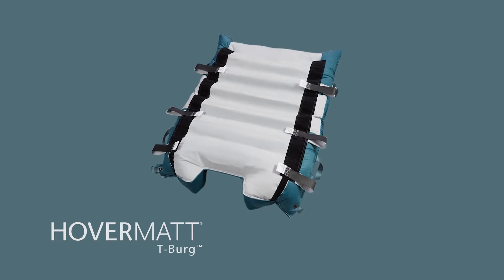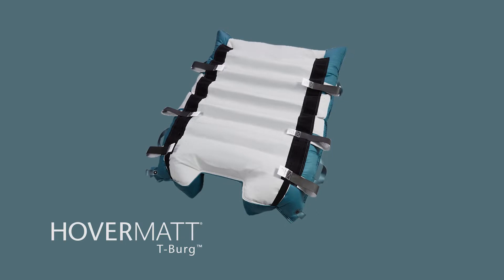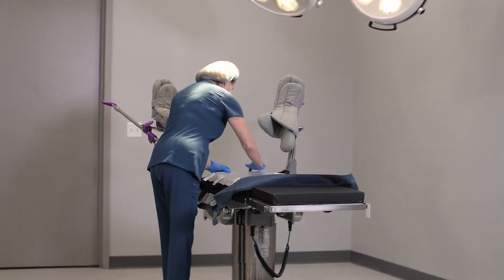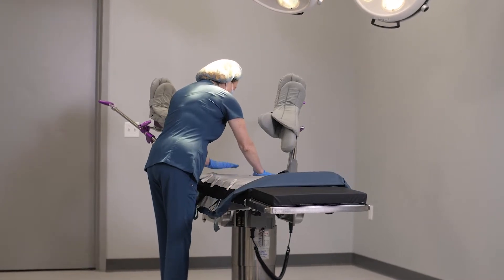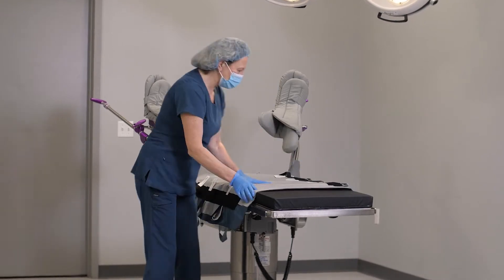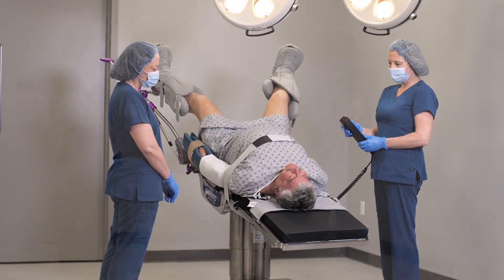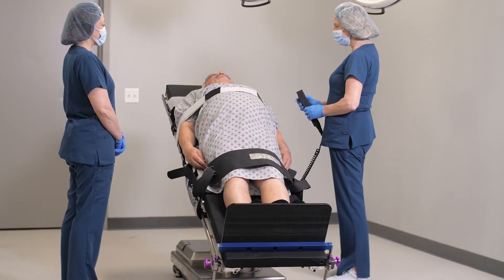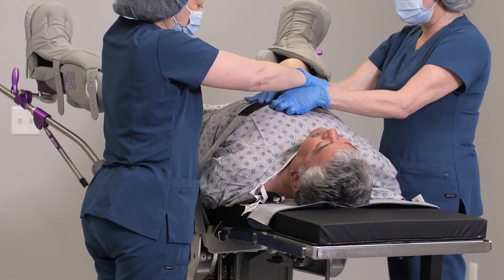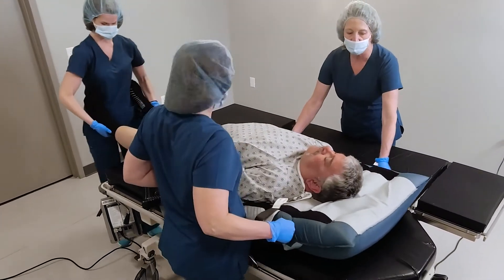The Hovermat Trendelenburg Patient Stabilization and Air Transfer Mattress, also known as the Hovermat T-Berg, is designed to address issues facing today's operating room team, especially staff caring for patients of size requiring stabilization and air transfer from the OR table to PACU. The Hovermat T-Berg can be used in robotic and other surgical procedures that require Trendelenburg or Reverse Trendelenburg positioning. This instructional video will show you how to set up the Hovermat T-Berg on the OR table and how to use this device to transfer the patient from the OR table onto a stretcher following the procedure.